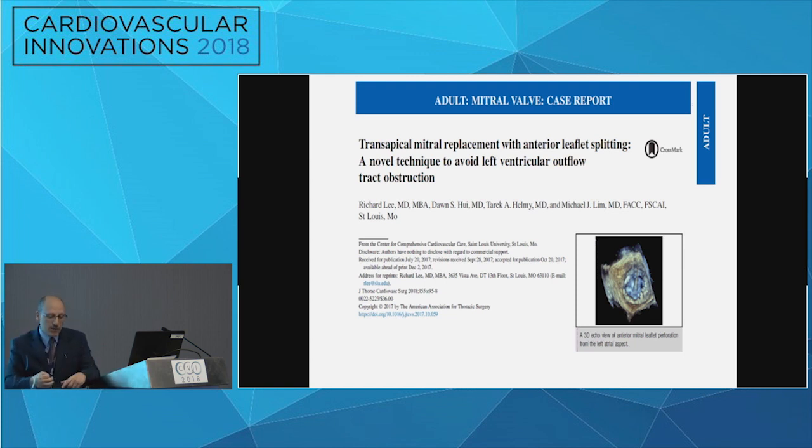Whether you like the laceration or the translocation like the surgeons do, I've talked to surgeons who say, we just slice it down. And some people said, you balloon it and you produce a laceration that is uncontrolled. Both are true. But on the one slide that I showed you, the valve is deployed within the anterior mitral leaflet, and we see a little tiny rim on the lumen side that actually contains the valve.